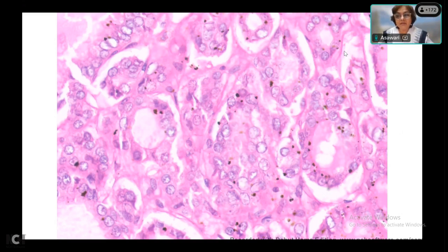Do you see solid pattern? Do you see the ring pattern? Nest. Oncocytic cell pattern, that is different. Oncocytic is a different subtype. Patterns, we are talking about the arrangement of cells. So commonest is the follicular one, and we are going to look at those thyroid tumors with follicular pattern, how to approach the diagnosis.